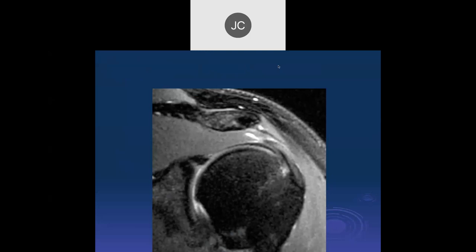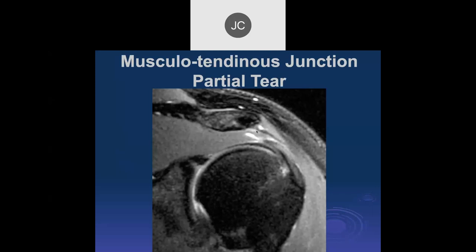Let's continue from where we left off last time — we're talking about partial tears. Looking at the supraspinatus tendon, is there an interstitial footprint tear? We can see a little bit of signal right in through here, and this was a partial tear involving the distal muscle right at the musculotendinous junction. These aren't that common.